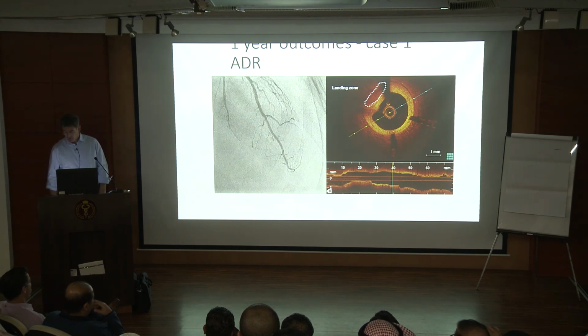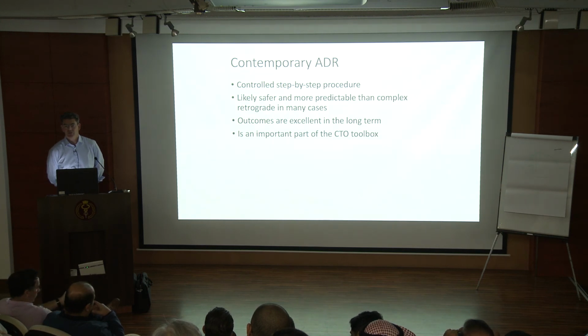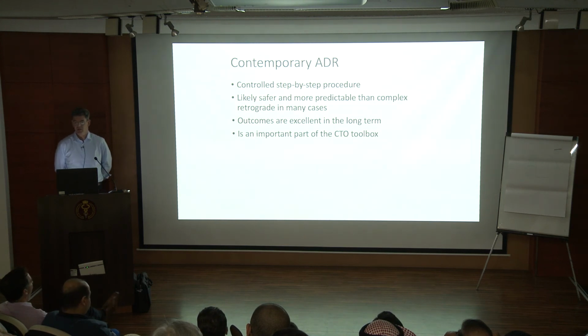The signal that we were getting, I think, is that there is an excess of events in retrograde dissection re-entry, and certainly in diabetic patients. But contemporary ADR is an extremely useful tool. It's been used in around 20% of cases, I think, in our experience, maybe a little more in some places.